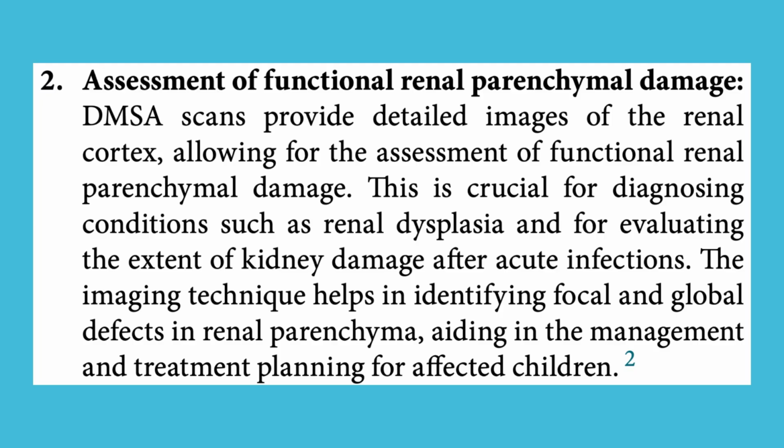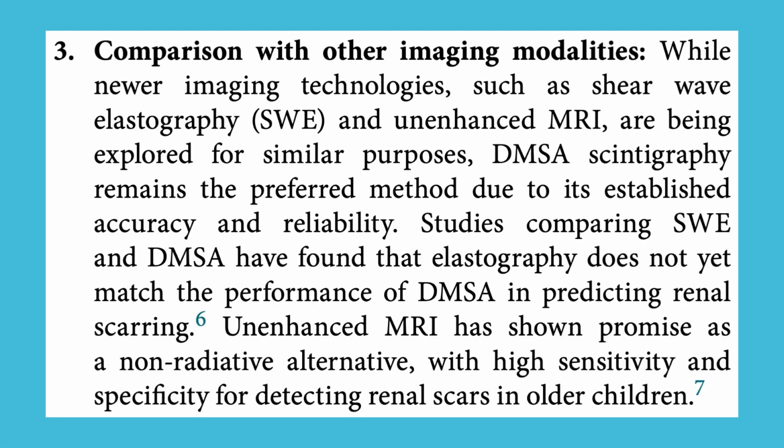2. Assessment of functional renal parenchymal damage. DMSA scans provide detailed images of the renal cortex, allowing for the assessment of functional renal parenchymal damage. This is crucial for diagnosing conditions such as renal dysplasia and for evaluating the extent of kidney damage after acute infections. The imaging technique helps in identifying focal and global defects in renal parenchyma, aiding in the management and treatment planning for affected children.